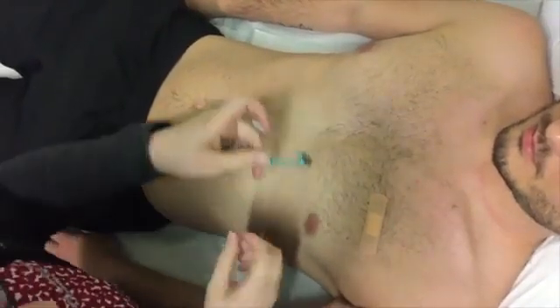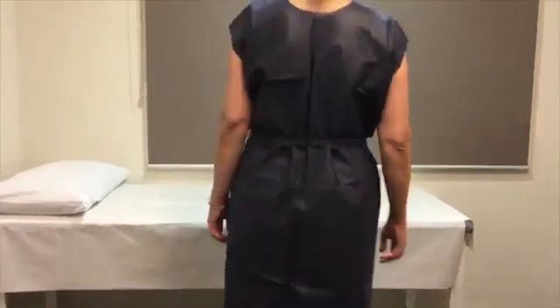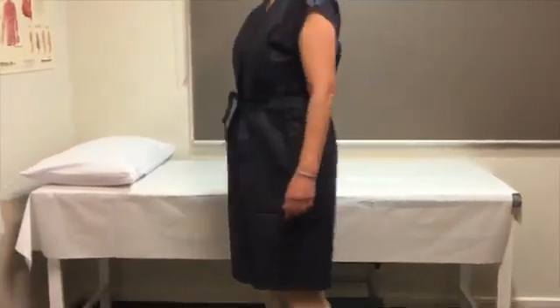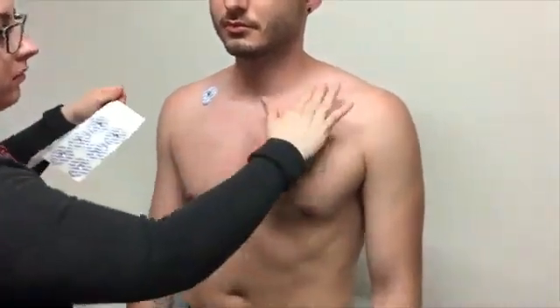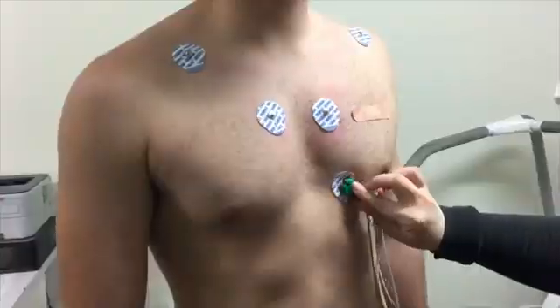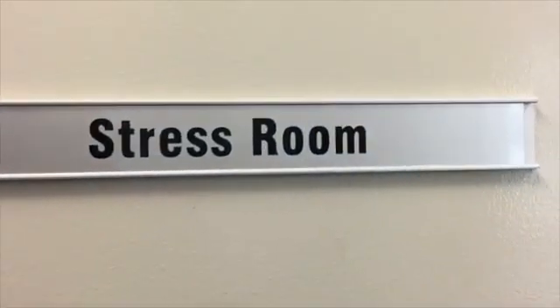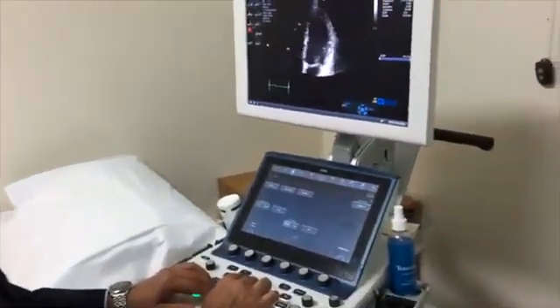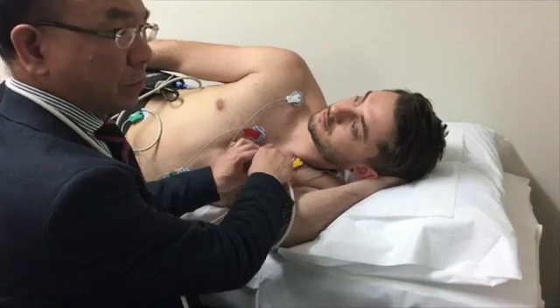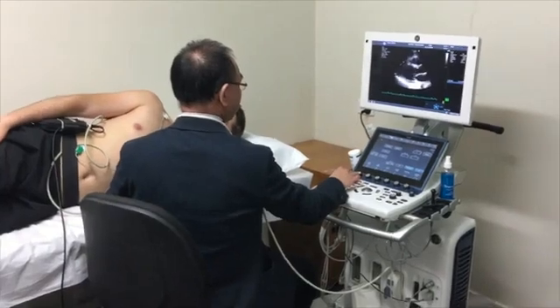ECG electrodes will be placed on your chest, and hair may need to be shaved off. Women can wear a disposable single-use gown. When you come into the stress room, you may find two other health professionals: one is a doctor, usually a cardiologist, and the other is an echo technician who will be performing the ultrasound of the heart.